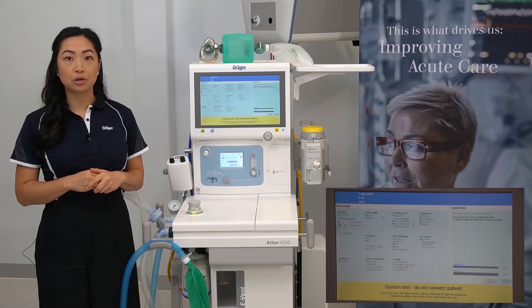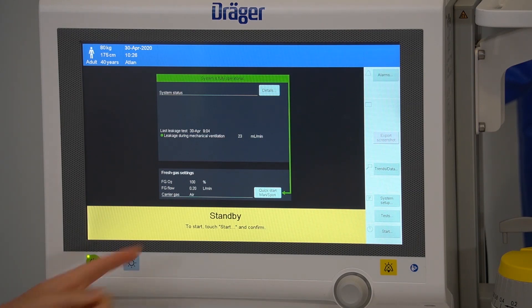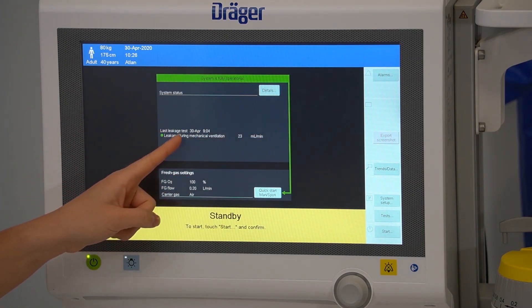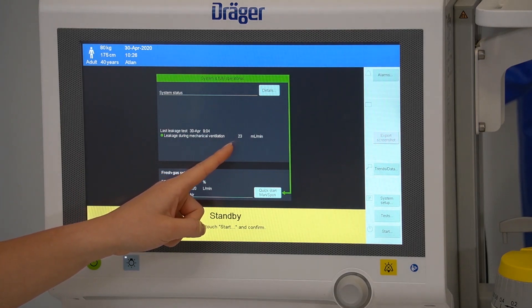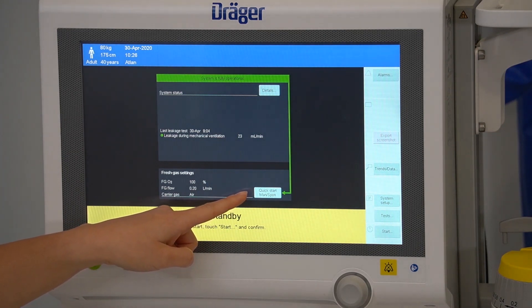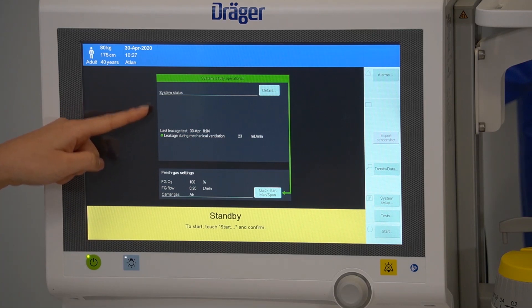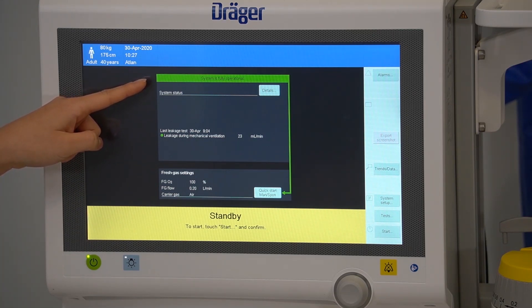The system test will run for approximately eight minutes but can be cancelled at any time. On completion of the system test, the device will return to the standby screen. Your system test results will be displayed here with the date and time stamp and the leakage indicated in mls per minute. A green banner represents that the system is fully operational and points you in the direction to start therapy. If this was yellow, it will indicate your system is conditionally functioning with some limitations or restrictions. If this banner is red, it indicates that a serious fault was detected — you will not be able to use the device and you should contact your biomedical engineer.